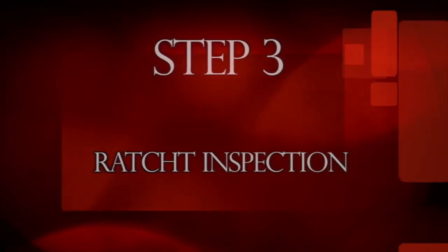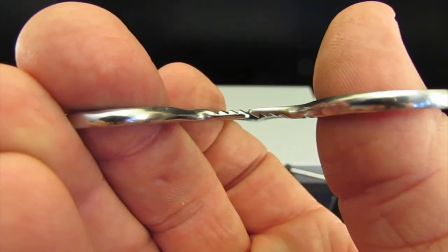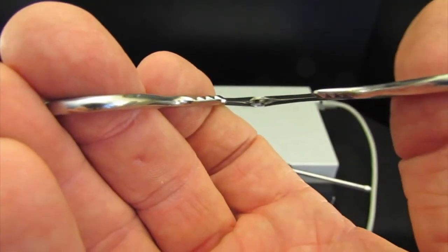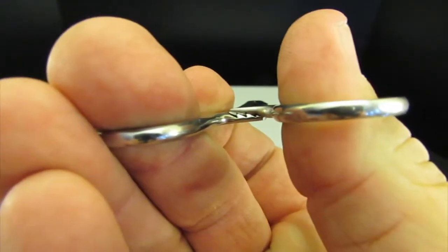Step three: ratchet inspection. When properly adjusted, the ratchets should be in a straight line in relation to each other. With the jaws closed, the ratchets should be almost touching and should mesh together at each closed step. With the ratchets completely closed, inspect how the ratchet teeth mesh together.